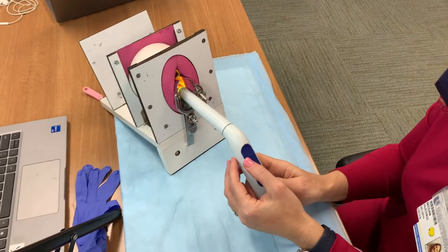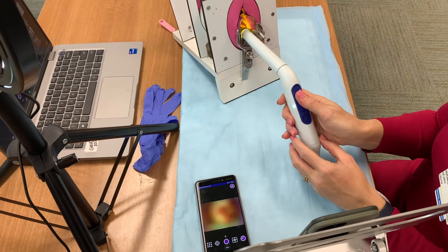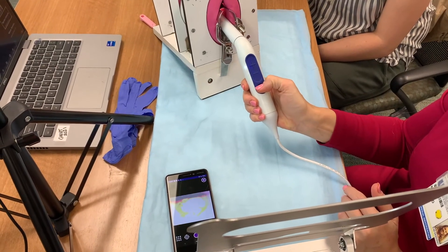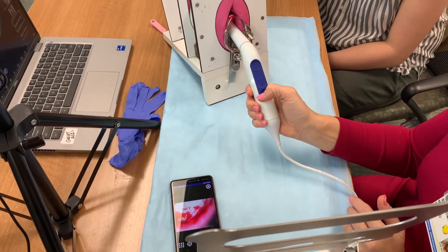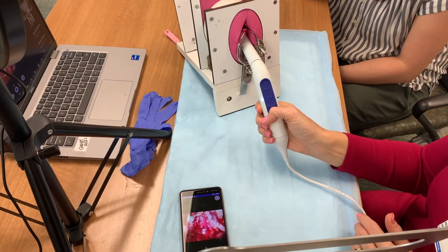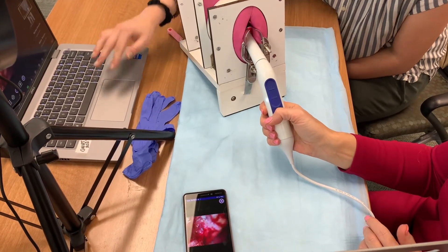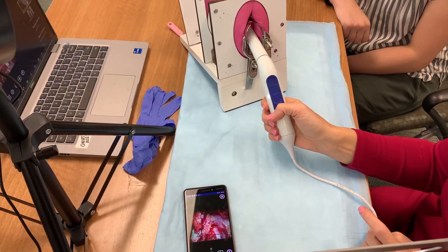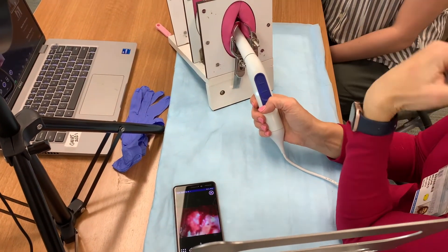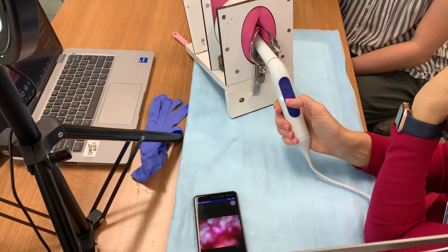If I feel like I need more zoom, I can hit the manual zoom. In practice, you don't use that zoom as much — it would really be in cases where you're concerned about cancer or you couldn't differentiate what kind of lesion it is.